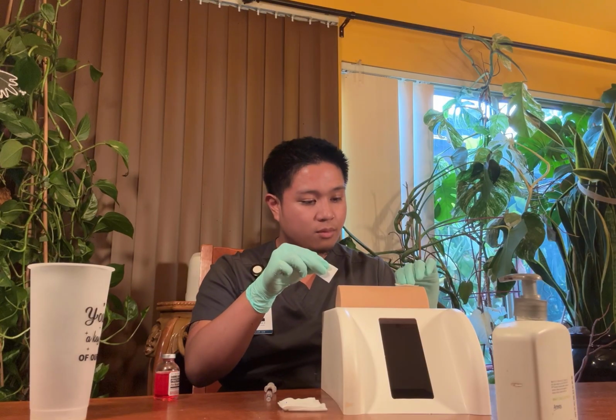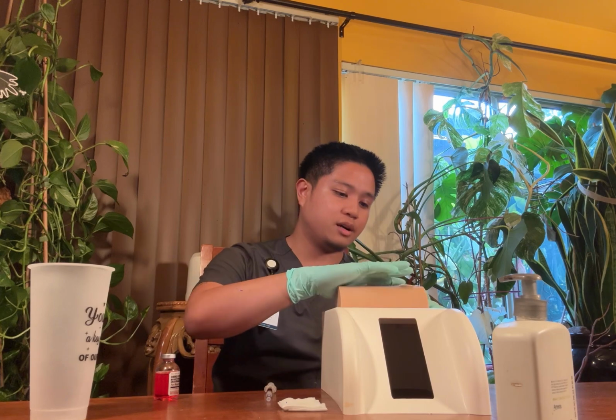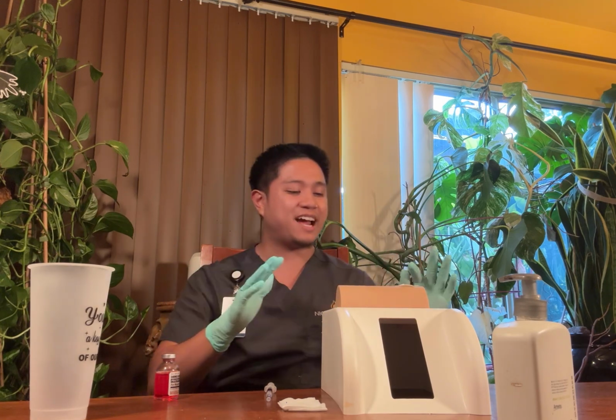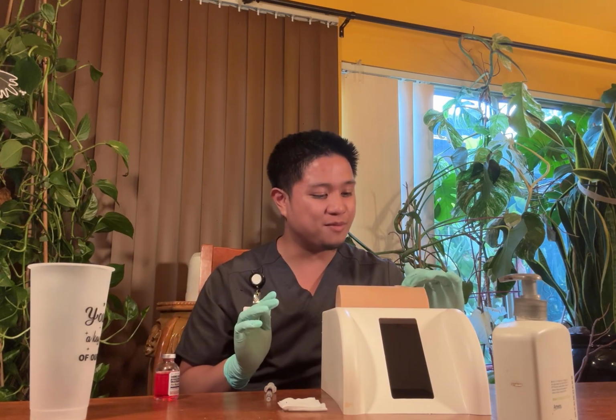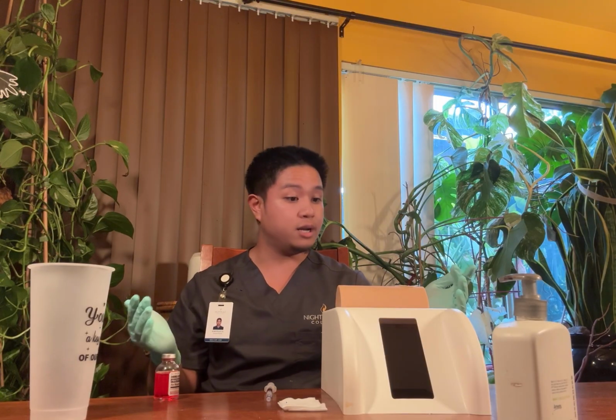I'm going to place the first alcohol pad back where I had it before I removed it, pointing at where I'm going to administer the injection.